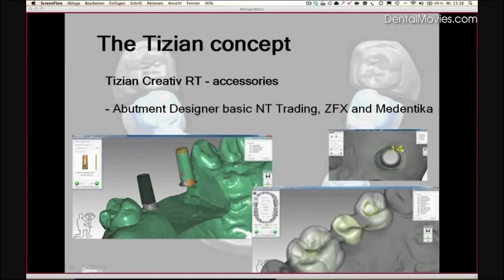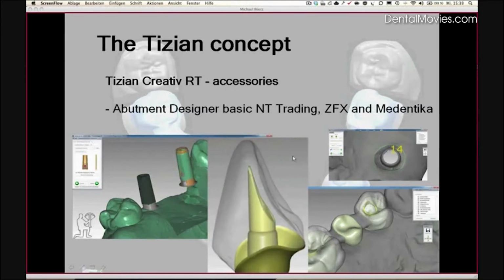Here we see the adjustment to the gingiva. So with this abutment designer, we scan also a gingiva model, and we will be able to define the adaptation to the gingiva of our abutment. And later on, we can completely construct the bridge in that case according to our needs.